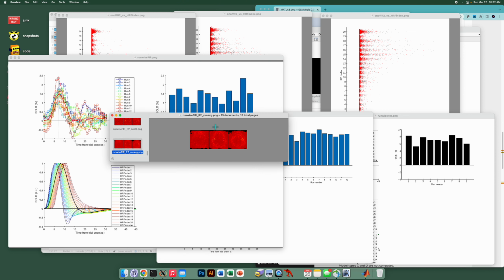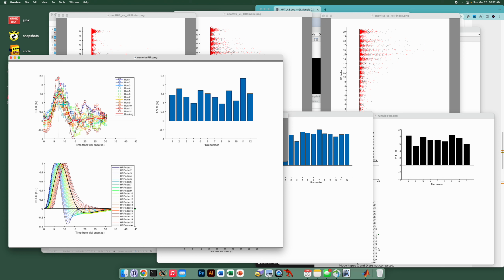Now, this mask is held constant across all of the runs, so we can directly compare what's going on, and we get an empirical estimate of the HRF, or the stimulus-evoked, or condition-evoked time course, averaged across all the voxels that we selected in each of the runs independently. And this gives us a lot of information as to potential things going on in this data set. Finally, the red is simply the mean of all the runwise estimates that we see here, and that's plotted here.